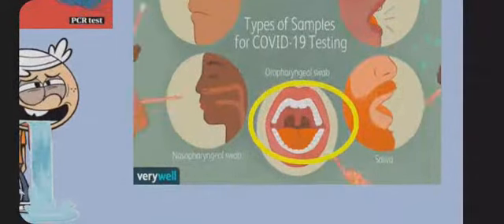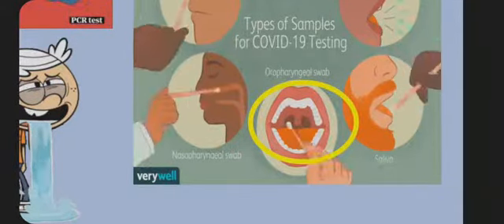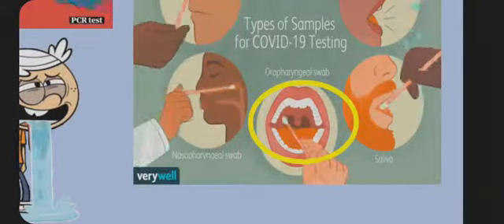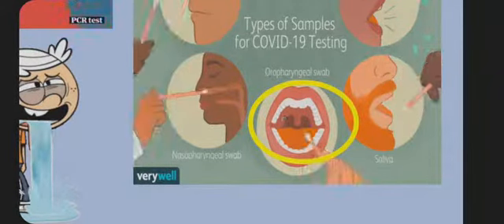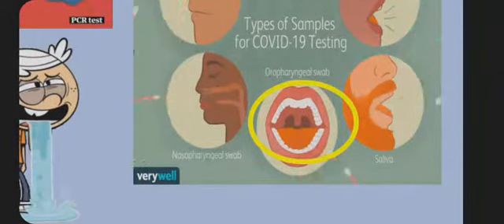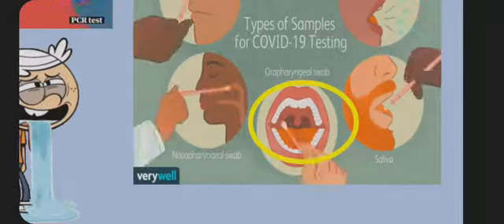As for the other method, it is the oropharyngeal swab. It is directed toward the rear wall of the oropharynx, and it is rotated a few times. After taking the sample, it is necessary to insert both swabs from the nasopharyngeal and the oropharyngeal into the same tube, breaking the rod with one swift and controlled movement. Finally, carefully screw the cap.